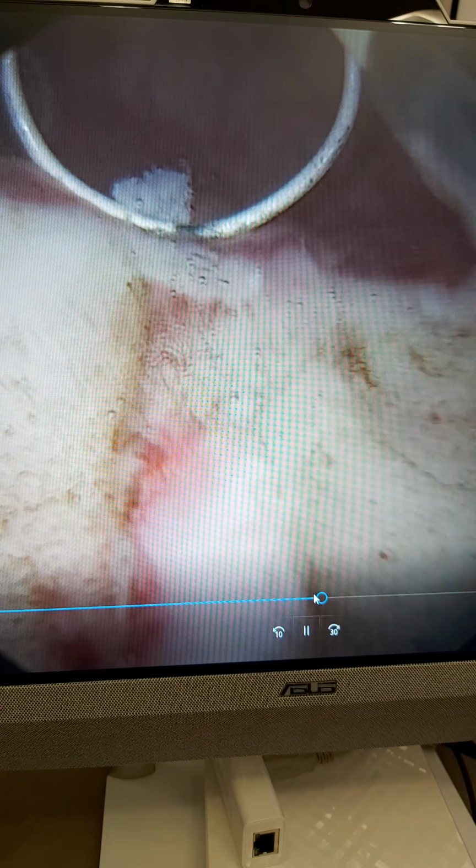When we understand that it's not possible to fulgurate these tissues, we begin resection. Of course, we don't want to go too deep, so the resection must be superficial, because deeper resection will lengthen the healing process too much and may cause too much pain.